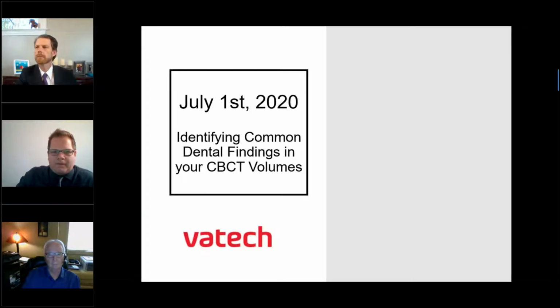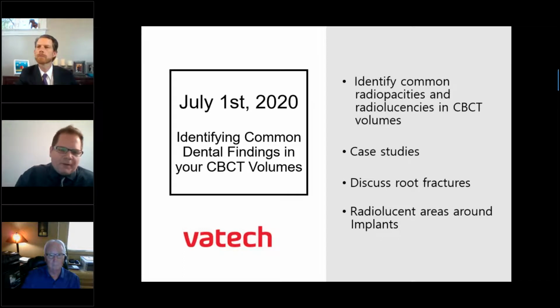Today we're going to be discussing common findings in your CBCTs. Dr. Miles will discuss common findings in your scans. A lot's going to be covered in this presentation, as you can see there. It's a pleasure to have him with us today.